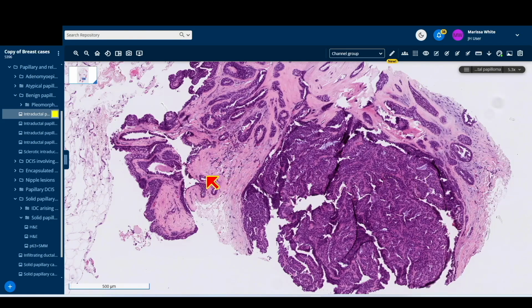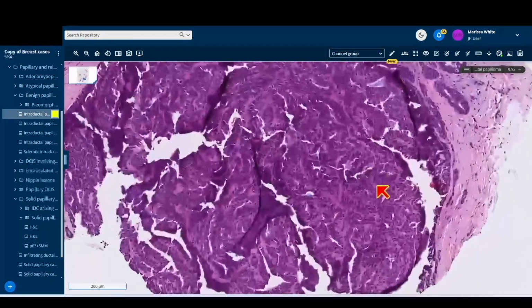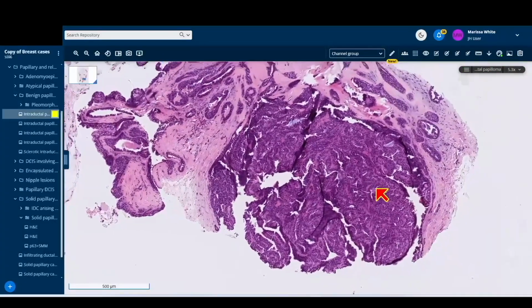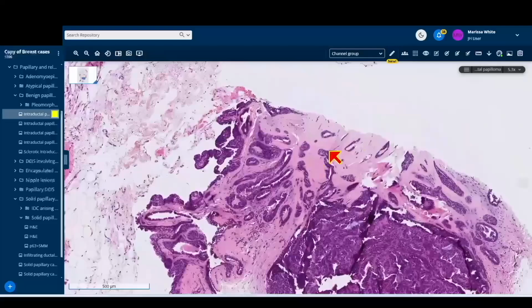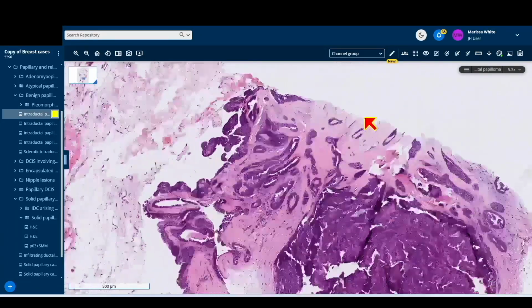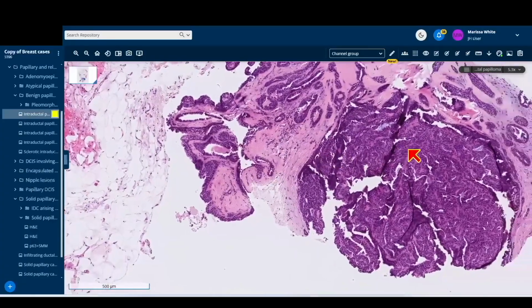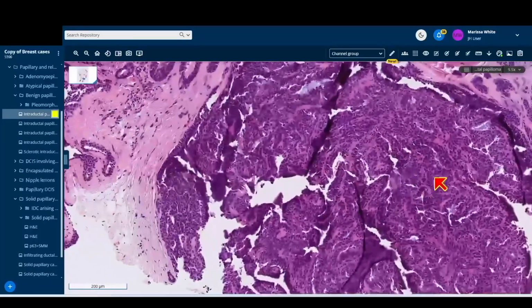Immunos, okay. So I don't have immunos for this one. But are we okay with a papillary lesion? Yes, okay. So papillary lesion for sure. And again, this is your clue that there might be a papillary lesion associated with it, and that this stuff here is probably papilloma. So I'm okay with this being a sclerotic intraductal papilloma with maybe some usual duct hyperplasia.